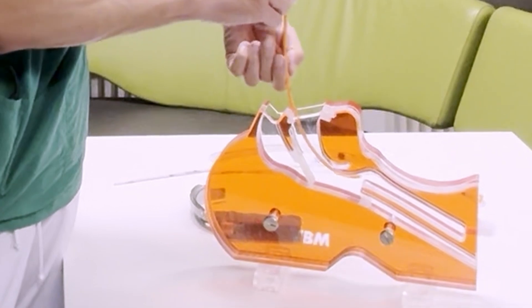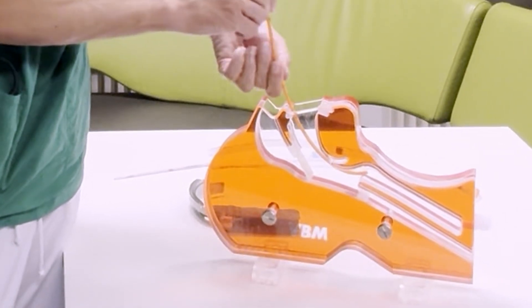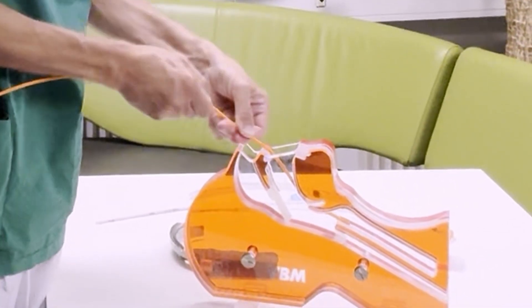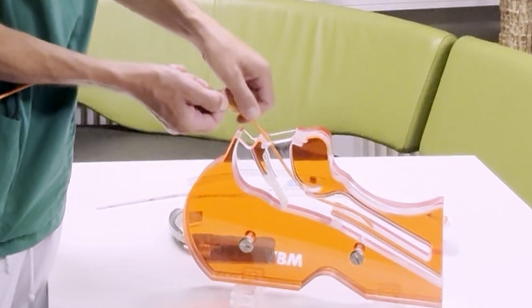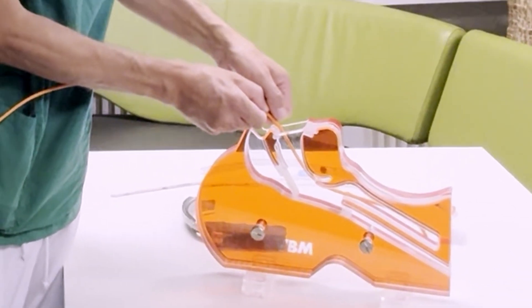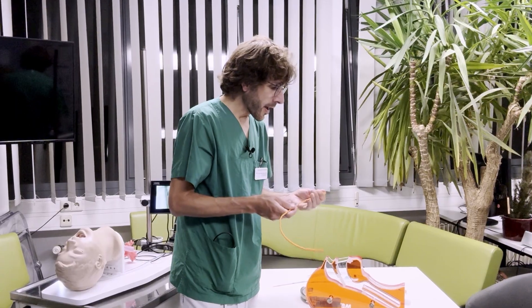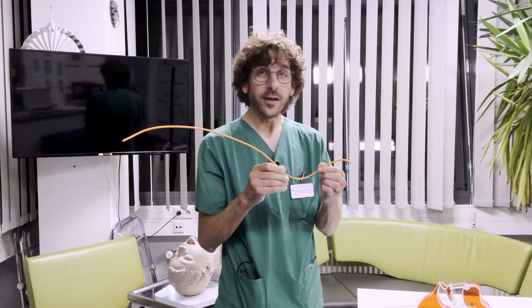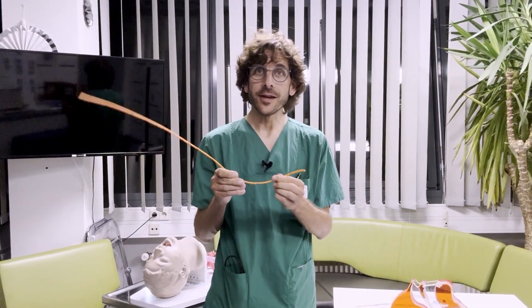We come around the tongue like this, and we then twist the device 180 degrees in order for it to smoothly go down into the trachea. In order to do this twisting movement, you need a soft device like a bougie where you can do this twirling movement I showed at the beginning of the video.